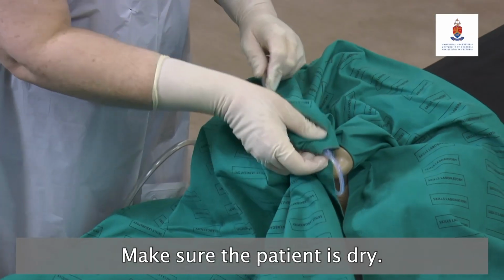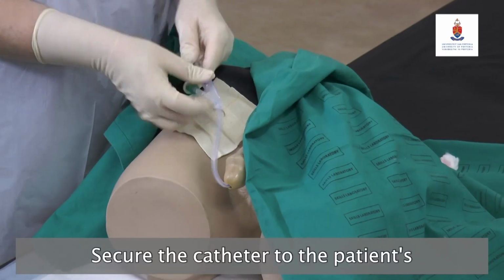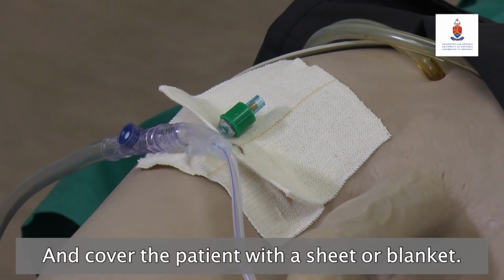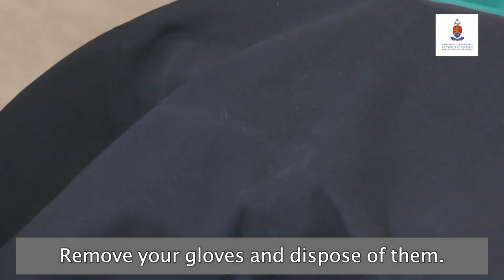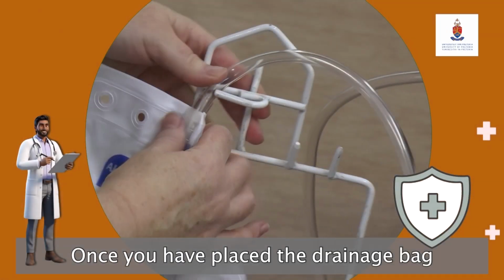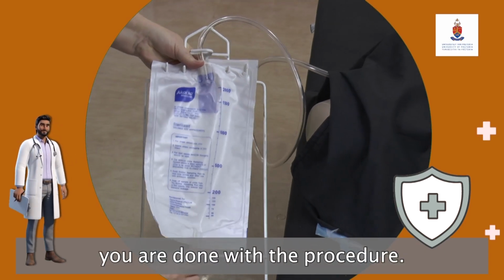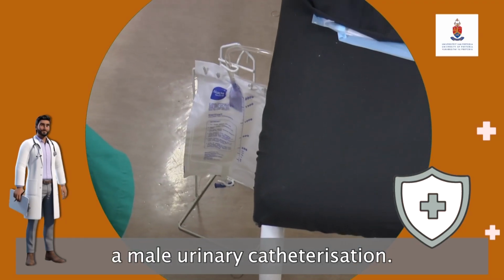Make sure the patient is dry. Secure the catheter to the patient's upper medial thigh. And cover the patient with a sheet or blanket. Remove your gloves and dispose of them. Once you have placed the drainage bag on a catheter stand below the level of the bladder, you are done with the procedure. You have successfully completed a male urinary catheterization.